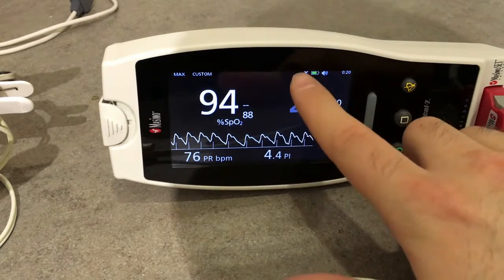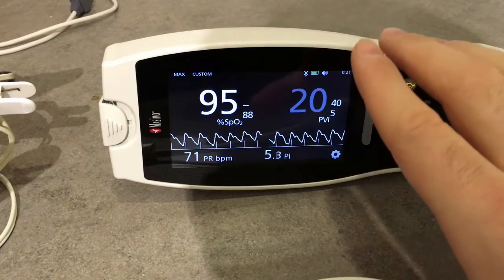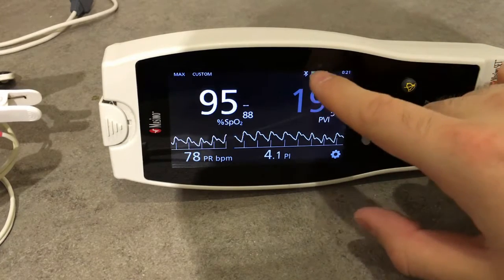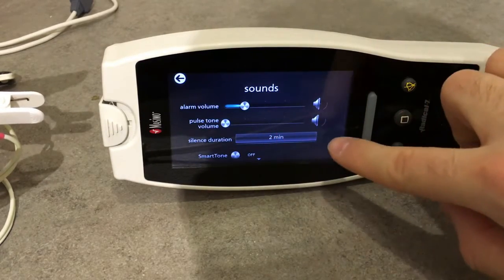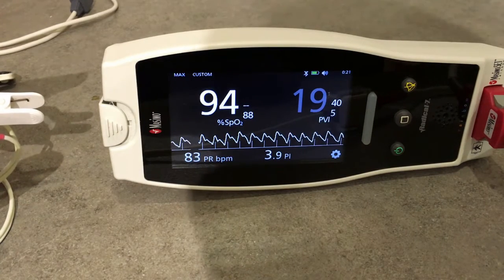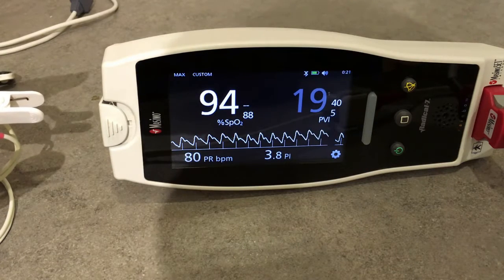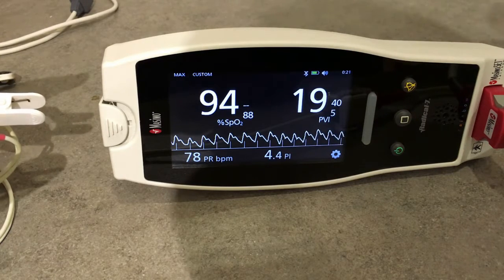Here we can set Bluetooth to connect this device to the Root monitor, so we can use this one on the patient and have the values on the Root monitor as well. We can access battery settings and volume settings where we can set alarm volume, pulse tone volume, silence duration, and Smart Tone. Some settings are present in different menus, which is redundant but useful — it allows quick access without having to dig through several menus.